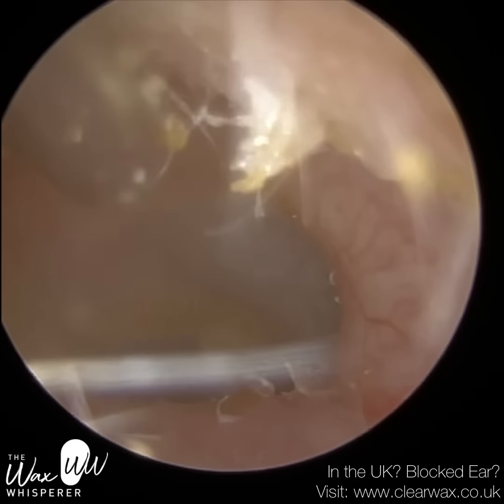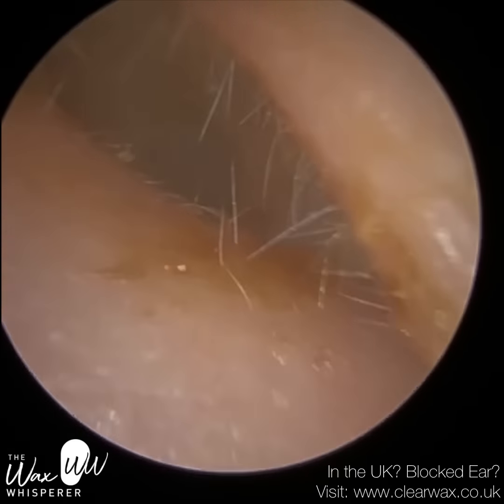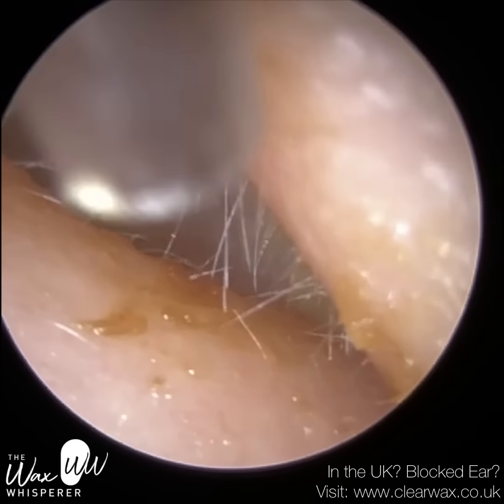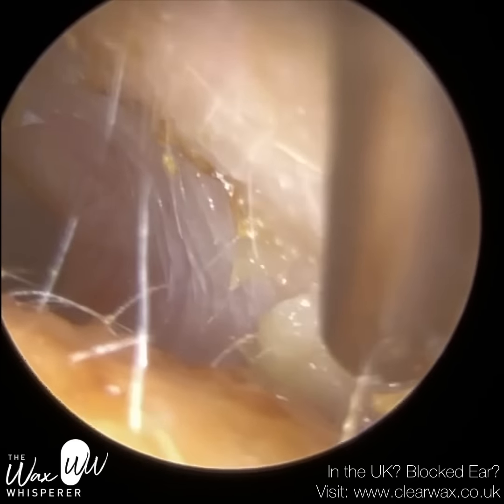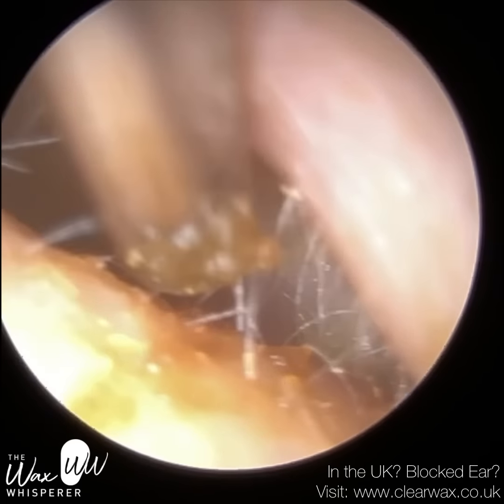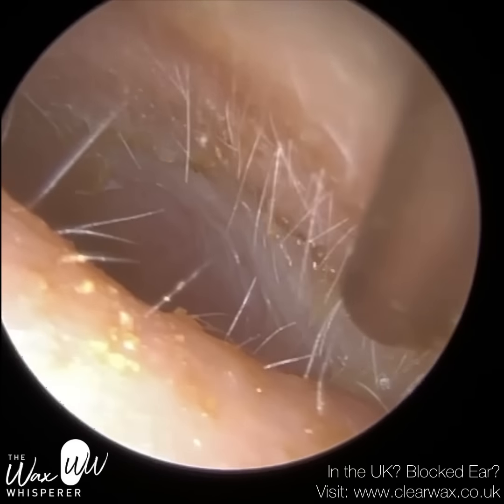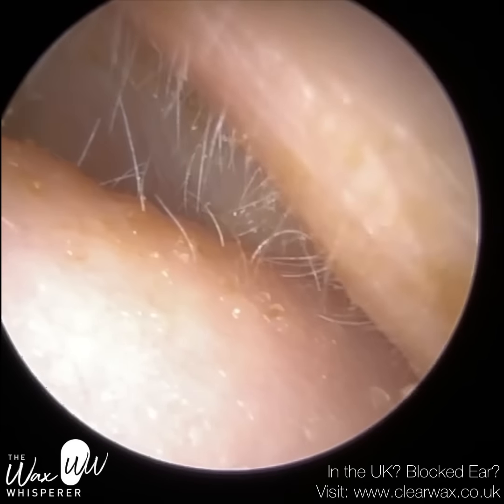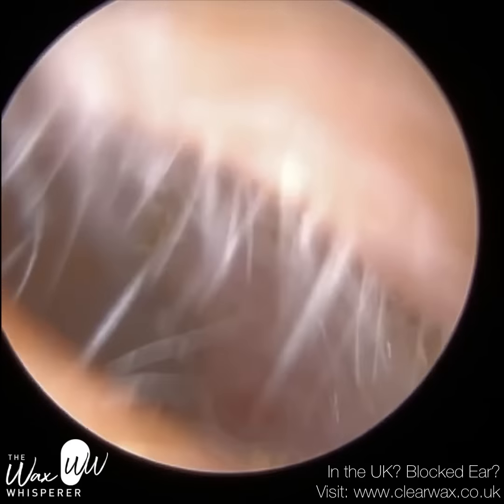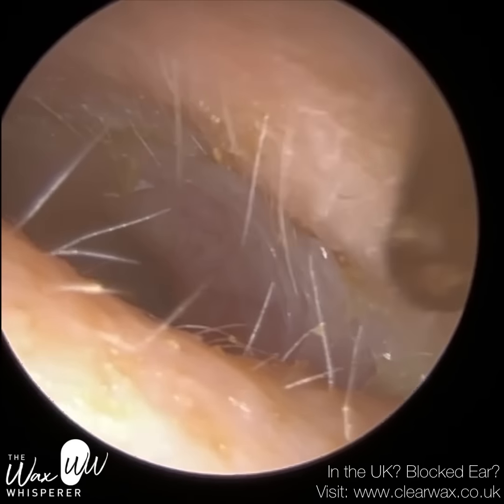Just to give you some perspective: the average ear canal varies in its dimensions. Our ears are oval-shaped — they're not cylindrical, not round tubes. They have an oval geometry, which means the height is greater than the width. As you can see here, the height of this patient's ear canal is significantly greater than the width — more so than the norm. It's more of a slit ear canal entrance. The average width of our ear canals, of course, varies significantly between adults, children, males, and females.